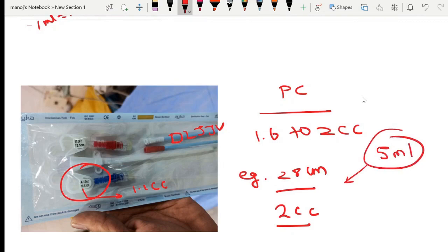So this is the right concentration for making the gentamicin lock solution. Thank you.